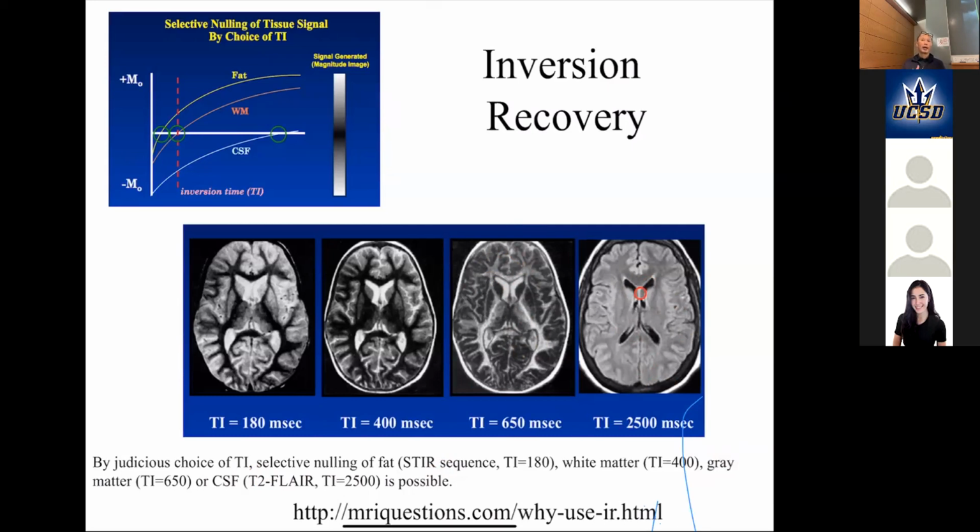If the radiologist has some prior indication of what they're looking for, then they say, well, make sure you get this sequence or that sequence. Typically at UCSD, there'll be a standard protocol, for like tumor, for MS. So there are set protocols that the radiologist can say, just do that set protocol. And depending on if there's added information, they say, do that set protocol plus add these things. Okay, so that's the radiologist's job. And then when they get the images back, their job is to interpret the images and make recommendations to the referring physician. Okay.